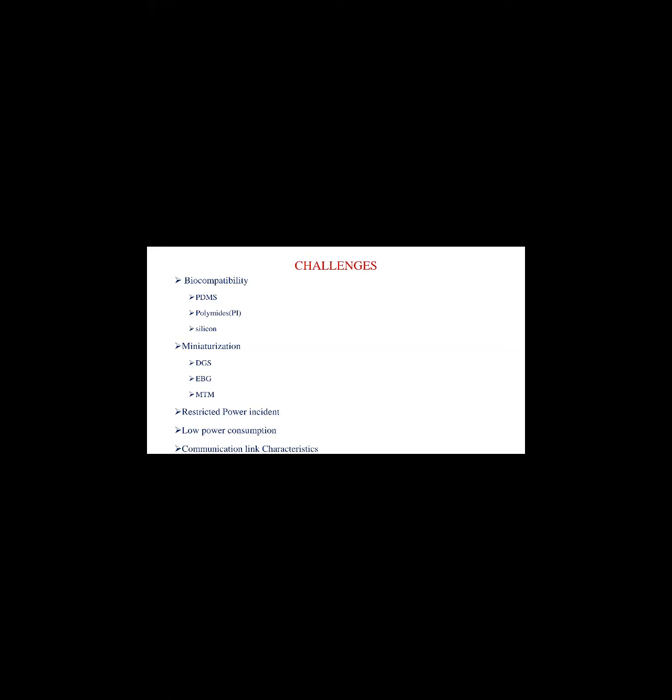It has a variable dielectric constant. It can vary from about 2 to 2.8 epsilon with different frequency ranges from 1 to 50 gigahertz. We can access PDMS. And also we are using polyimide. So this actually comes under the category of biomaterials, like polyimide and polydimethylsiloxane. And also we have LCP and silicon. These are all special properties of polymers because we are combining different ceramic materials and different metals. They can be used for implantable antennas for a long lifetime of your patient.